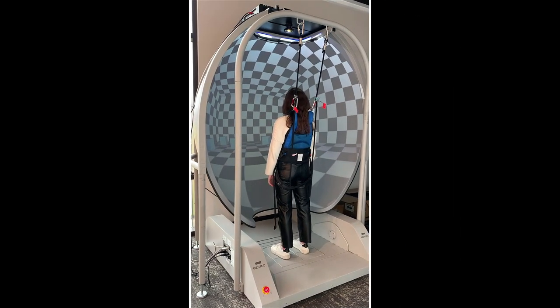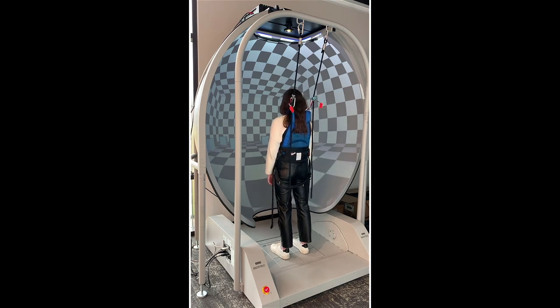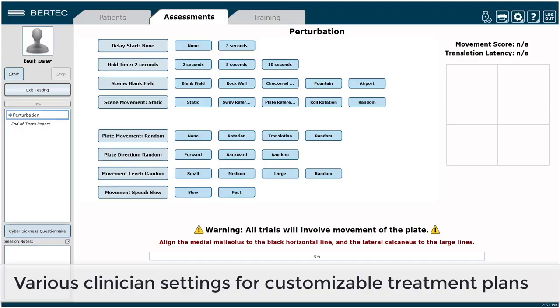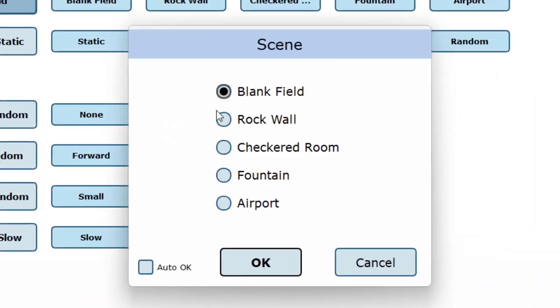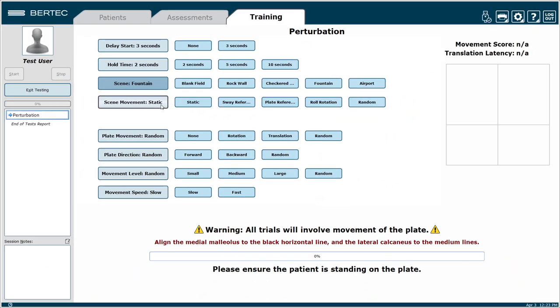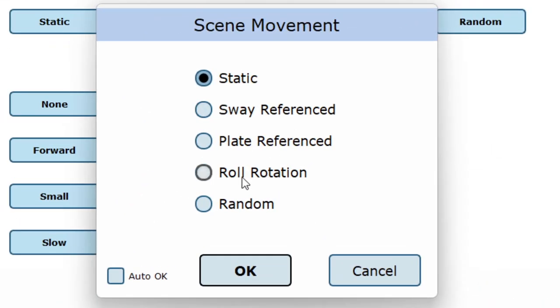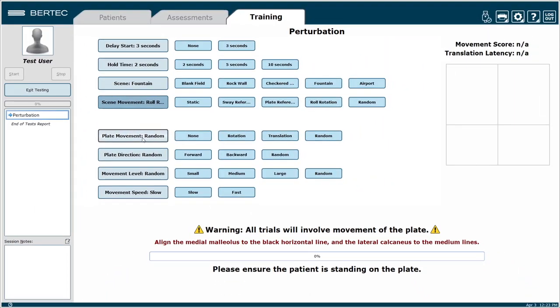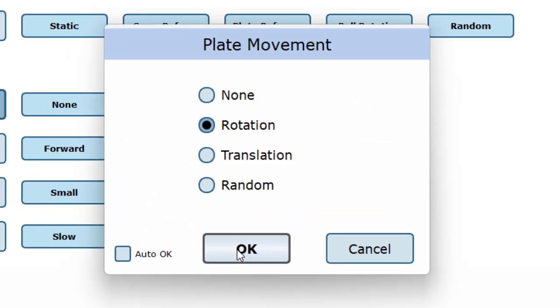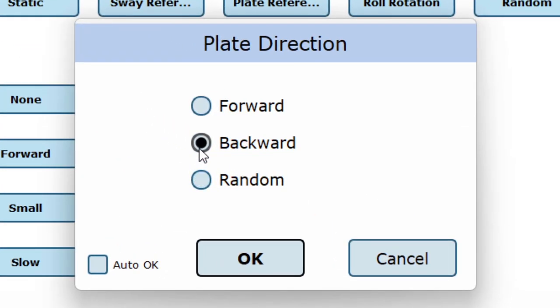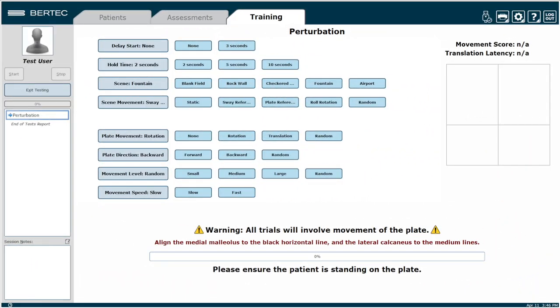Perturbation training uses the CDP system to create environmental changes that encourage patient adaptation to improve their balance. This training module has new visual and proprioceptive training features with various settings, which allows you to customize your treatment plan with various scenes, scene movements, plate movements, and plate directions. These create sensory mismatch and vary training difficulty by allowing for separate or simultaneous visual and proprioceptive motion.